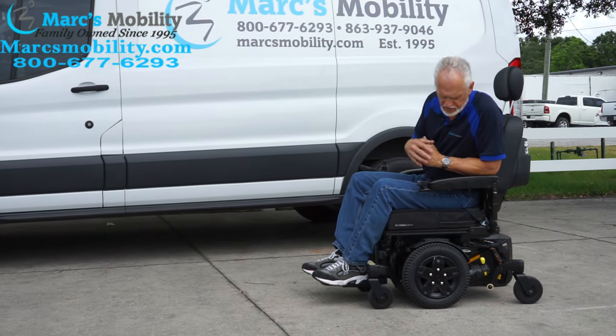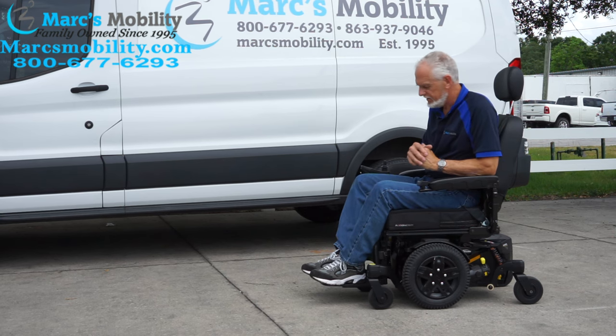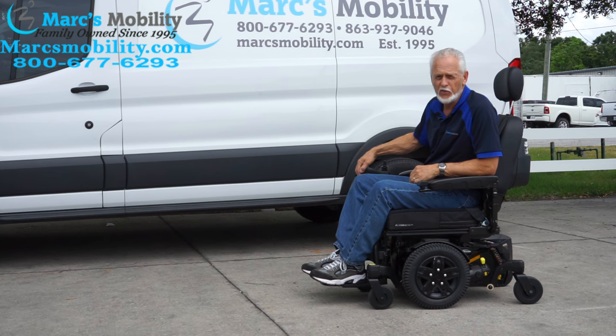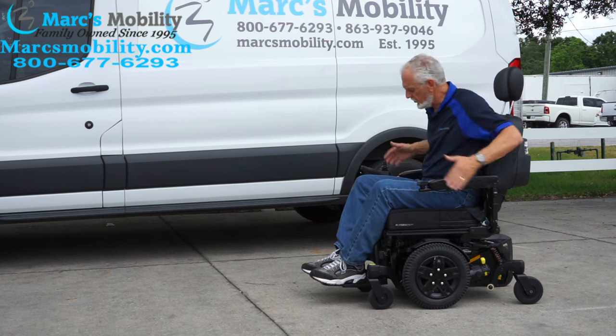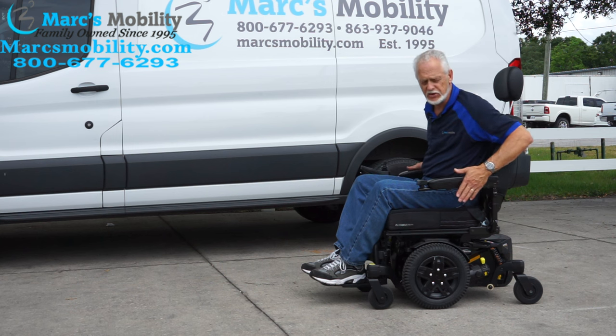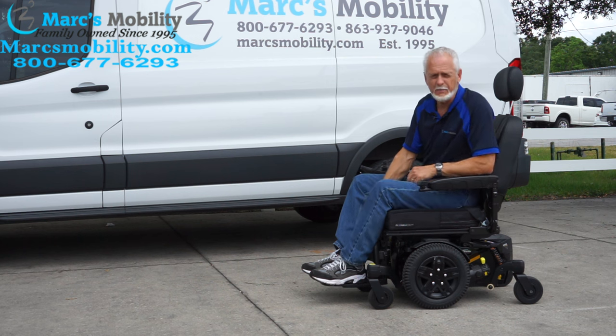Great power chair, great suspension. If you need a chair with electric tilt, electric recline, or electric legs, this would be a really nice power chair. Almost no miles on this one. Remember, the seat stays the way it is on this chair, so your arms are 25 inches from outside to outside arm, with the seat being 19 by 19.